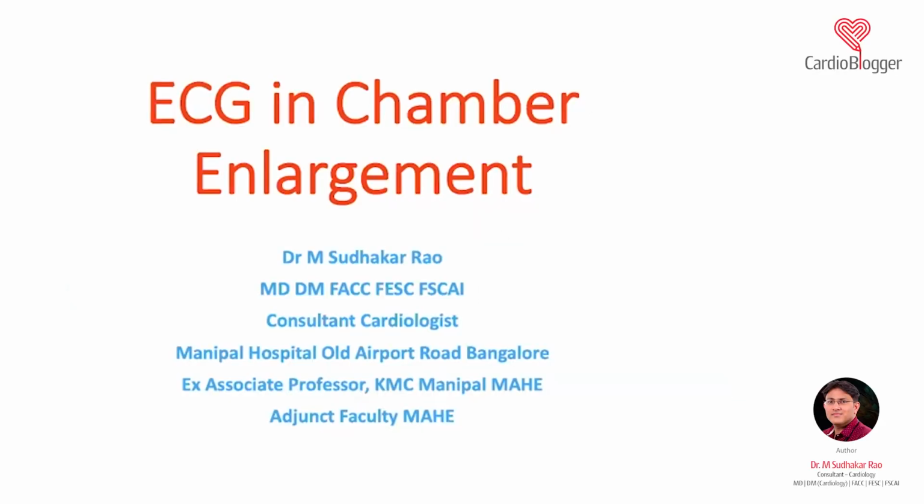Now, why this chamber enlargement is important also is because you will see many diseases of the left ventricle, like left ventricular hypertrophy, which is caused by aortic stenosis, systemic hypertension, coarctation of aorta, or hypertrophic cardiomyopathy, or diseases like mitral and aortic regurgitation, where volume overload causes the left ventricular hypertrophy.